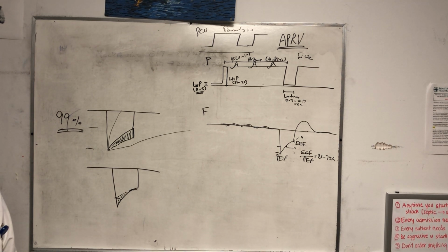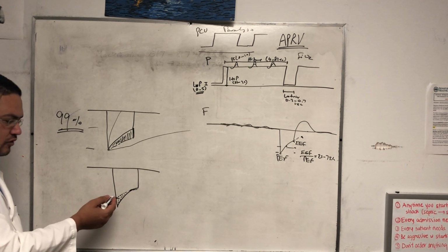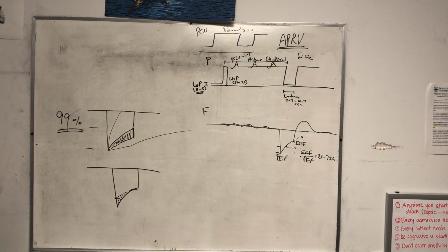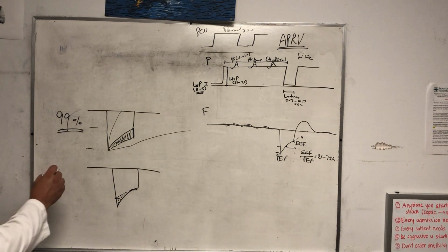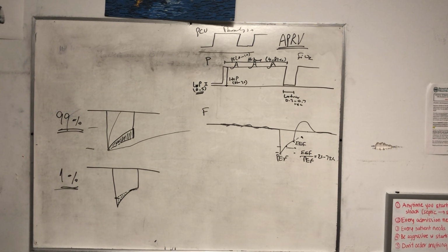So that's obviously happening in what? Bronchospasm. Because in bronchospasm or COPD, you can't exhale. The exhalation is not fast, so you're muffled a little bit in your peak expiratory flow, and that's why they approach each other, and it looks like this, and you lose tidal volume that way. But this is only 1%. It really, really very rarely happens.